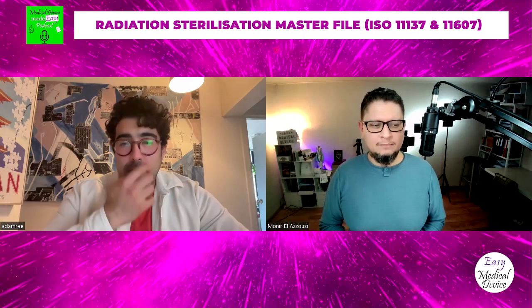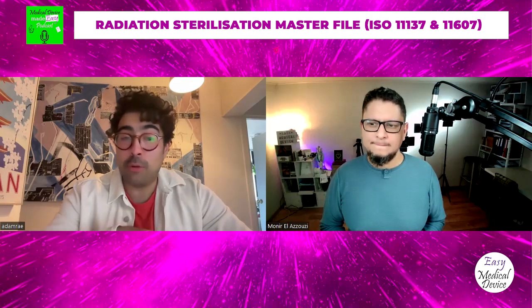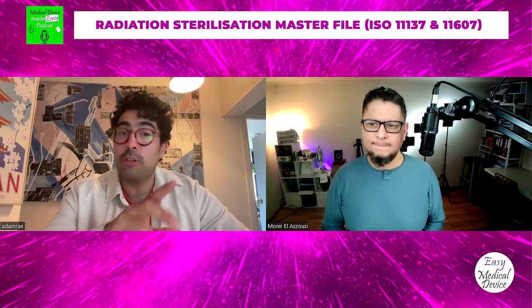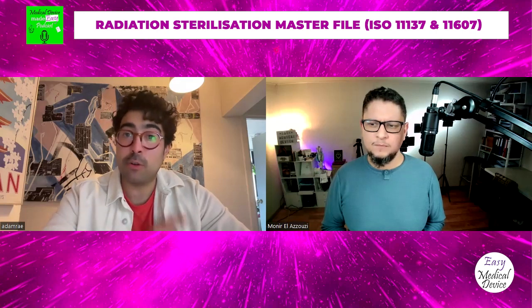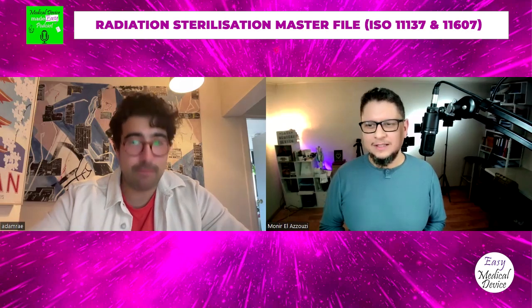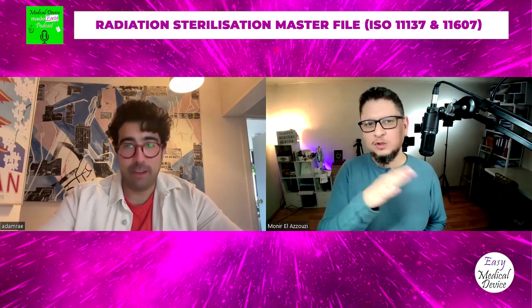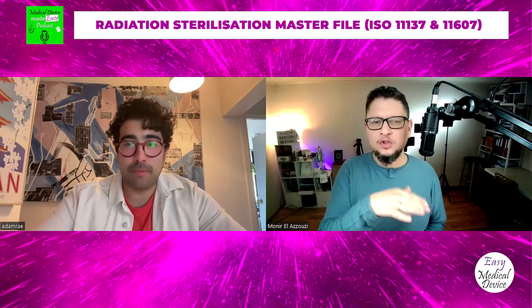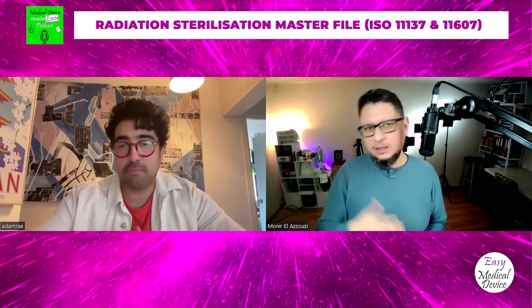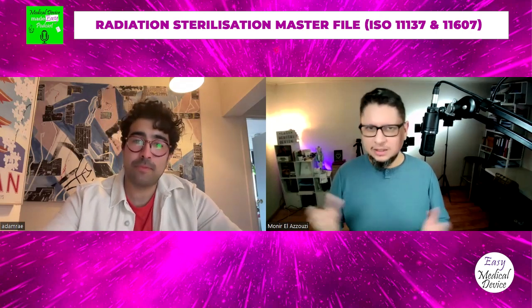But if it's just a one-time issue, it can be easily corrected. Sorry, just the last one on that, Manuel. Not providing your calibration data on your validation for your sterilization master file would most likely be raised as a major as part of a technical review. This one, yes. It's different from a validation, because the validation will validate all the rest, all what you will do after. But if it's during production and it was already validated before, it's maybe less risky. But here, it's case by case.